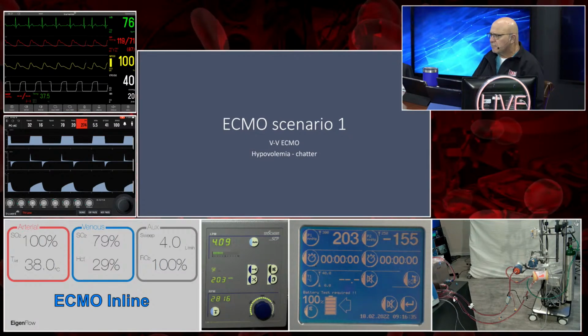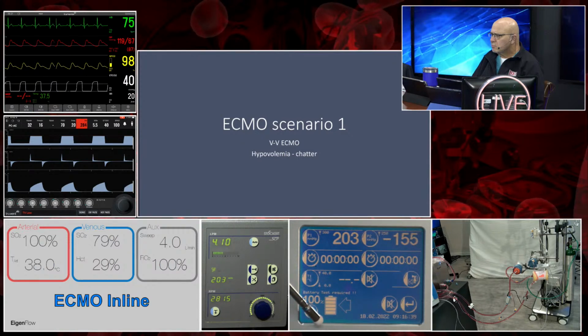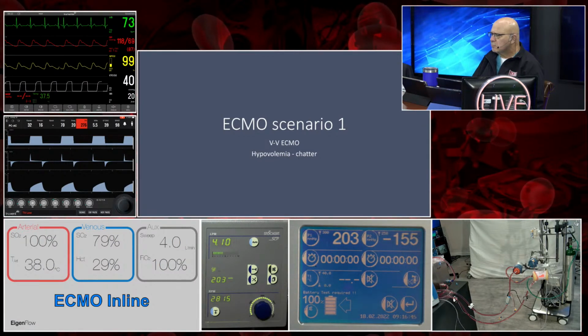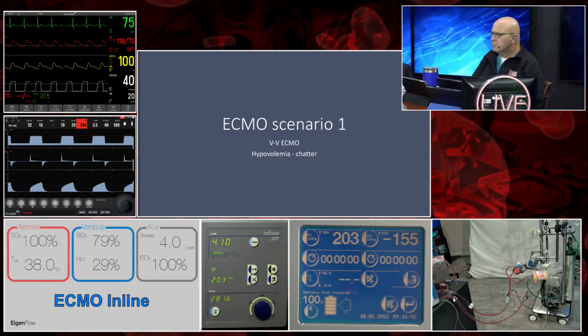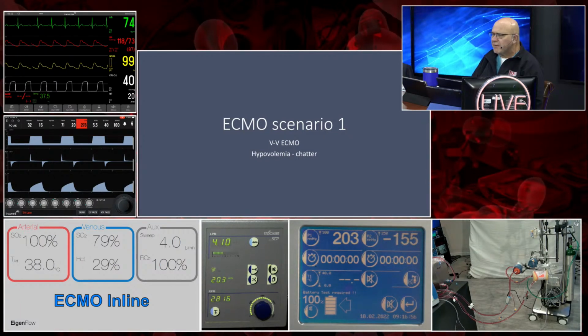Exactly. And point out one more thing, just out of interest, this is our battery life. These do have an excellent battery, so you're able to run on battery when you're doing transports around the hospital, getting to an ambulance, or doing anything that you need to do with the circuit itself. Perfect. Okay, very good.